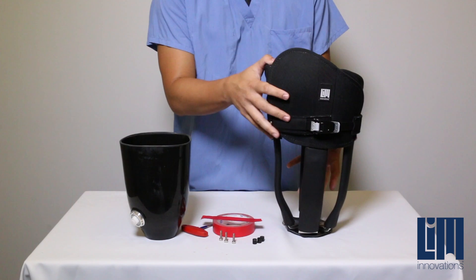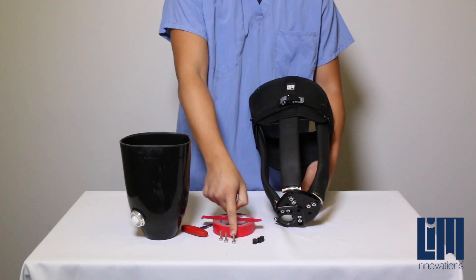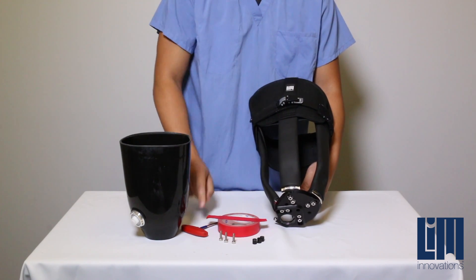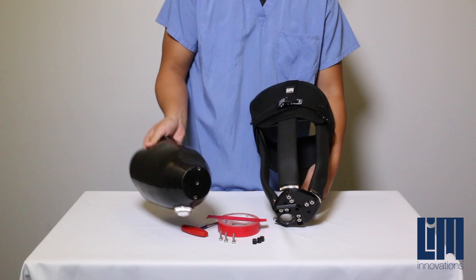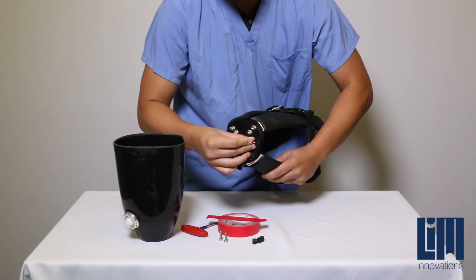To begin installation of the fill cup in the infinite socket, begin by identifying your components. This includes the infinite socket, the spacers, the mounting screws, a piece of painter's tape, a 4mm Allen wrench, and the fill cup.